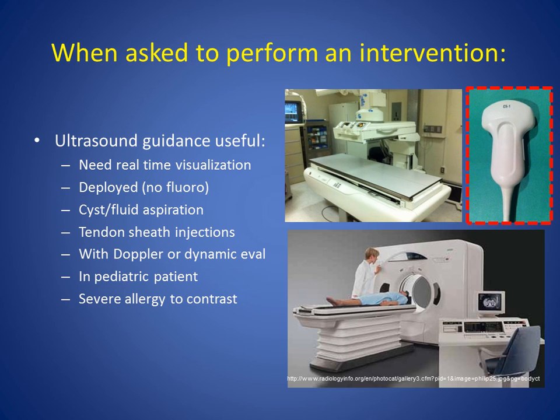When are we going to use ultrasound for guidance for needle procedures? We're going to use it if we need real-time visualization. Ultrasound is great for that. There's no ionizing radiation. We can see in real time the surrounding tissues, the target, and the needle.